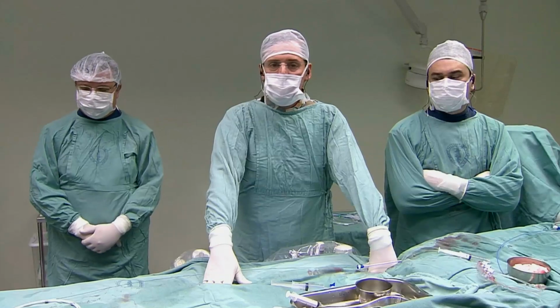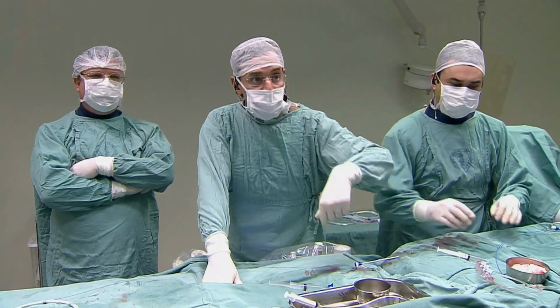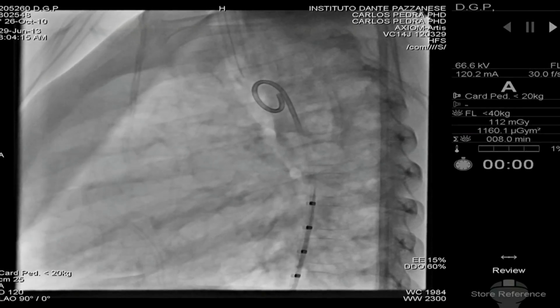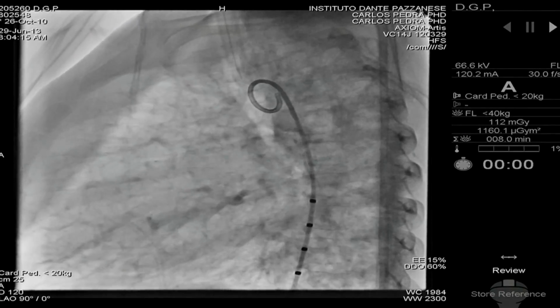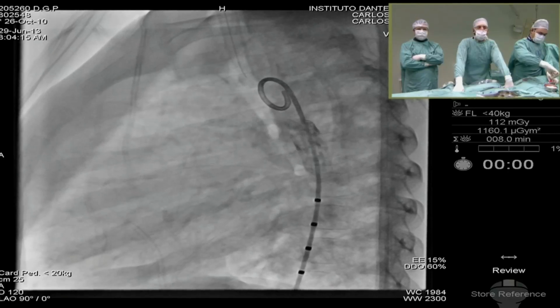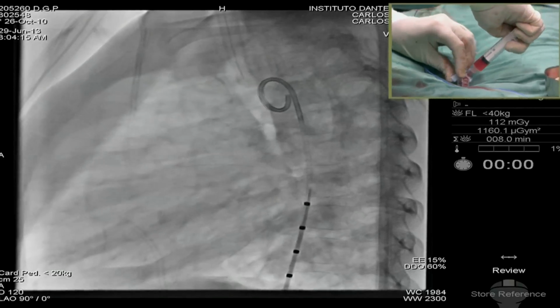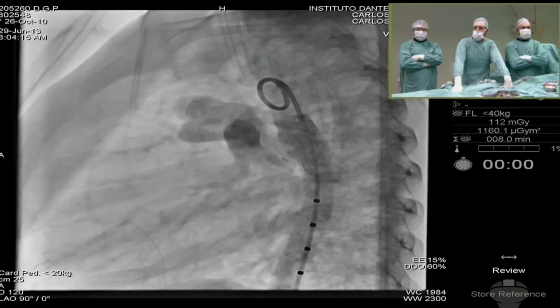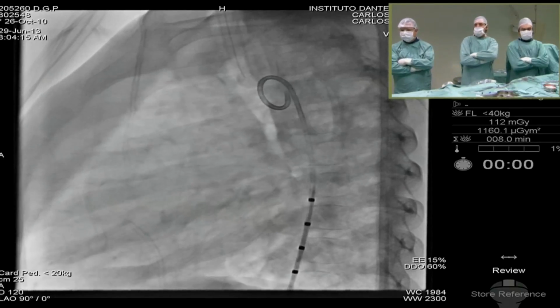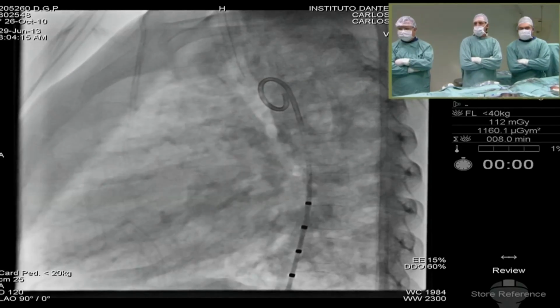in regards to pressure, we found aortic pressure. Can you turn on the aortic pressure? Pressure 90 over 33 with a mean of 55. In the pulmonary artery, we have systolic 54 over 24 with a mean of 34, so significant pulmonary hypertension. The QP-QS was 3:1, so significant shunt. The LVED is 20, which gives us a pulmonary vascular resistance less than 2 units.